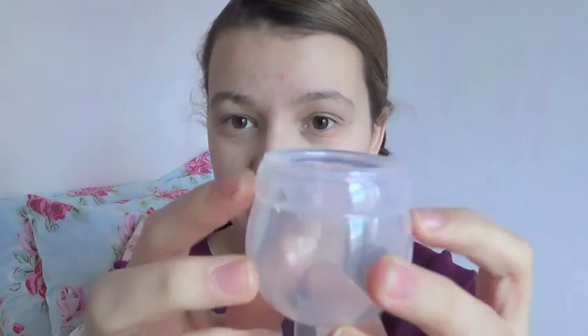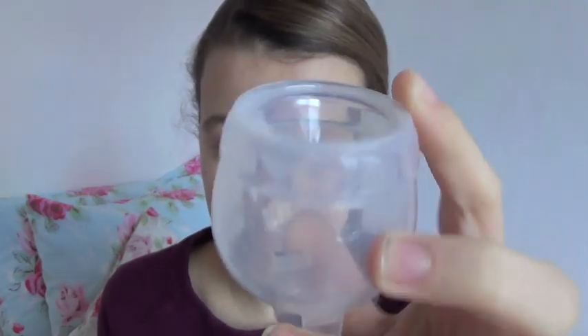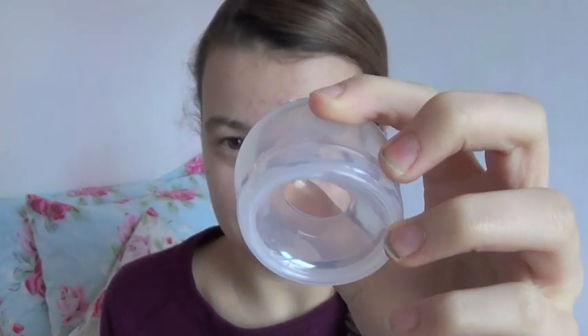I unfortunately don't know the retail price of this, but I do know you can get it in the US. I don't think there's anywhere in the UK you can get it — I think you have to go through FemiCycle's own website. The cup feels very nice; there's nothing about it that I don't approve of. The seams are very smooth so they're not going to chafe, and there are no ridges on the cup body, so if you get a lot of irritation from grip rings this is definitely a cup to consider.